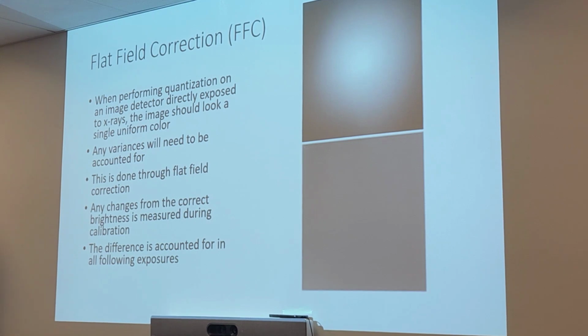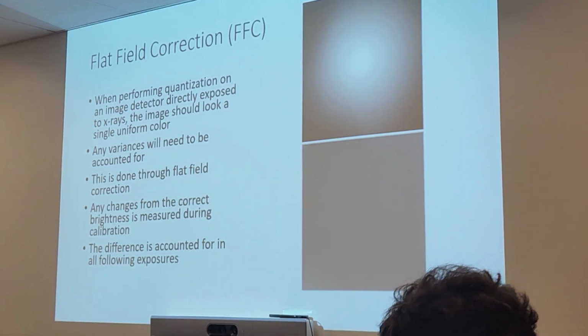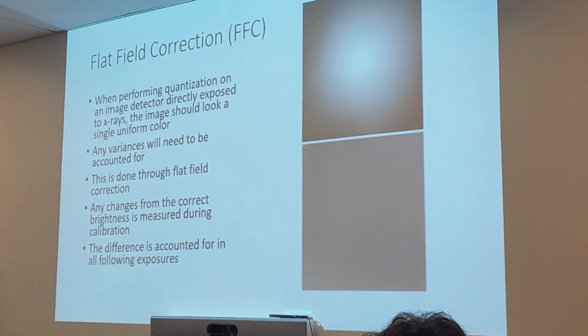Is it just because the machinery gets old that it does that, or does it come naturally like that? It's just natural, right? Because you've got the different detectors, either your TFTs, your CCDs or your CMOS. They're not all exactly identical, they all have slight variations. So we just need to calibrate them, put everything onto the same level. We're basically just setting a baseline for all the detectors inside the IR.